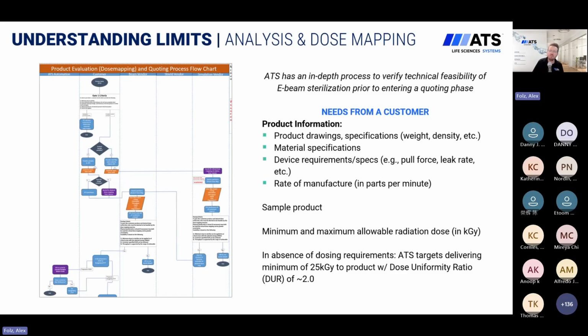We're looking for that minimum level to verify sterilization, and on the maximum side, looking to see at what level of radiation dose you start to see degradation of the part. That's important for us to know as well. In a case where you don't know those minimum and maximum, ATS is typically targeting delivering a minimum of 25 kilogray to the product with a maximum dose uniformity ratio of 2. That would suggest that in one area of the product, we deliver 25 kilogray with a maximum of 50 kilogray in another area of the product.